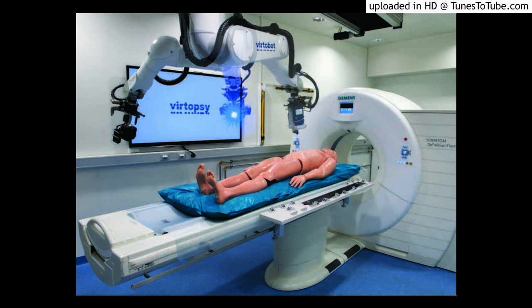They expressed different densities of restoration materials, such as composites, temporary fillings, and ceramics, in Hounsfield units, by ultra-high-resolution CT imaging. Ampanitsy et al. described the advantage of virtopsy to obtain information about the depth of trauma from sharp instruments.